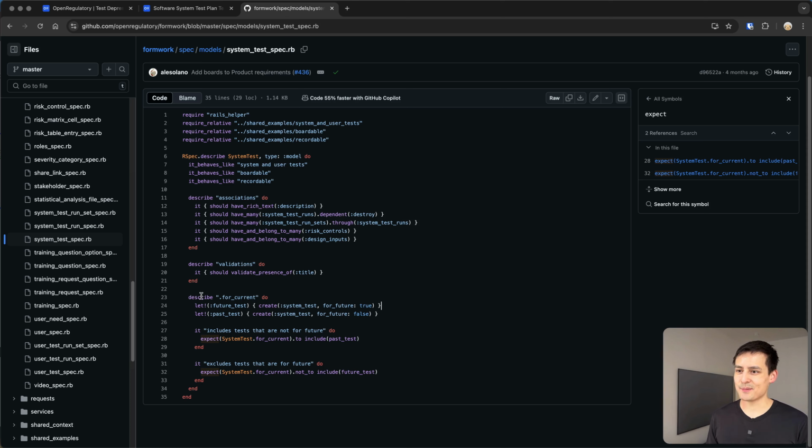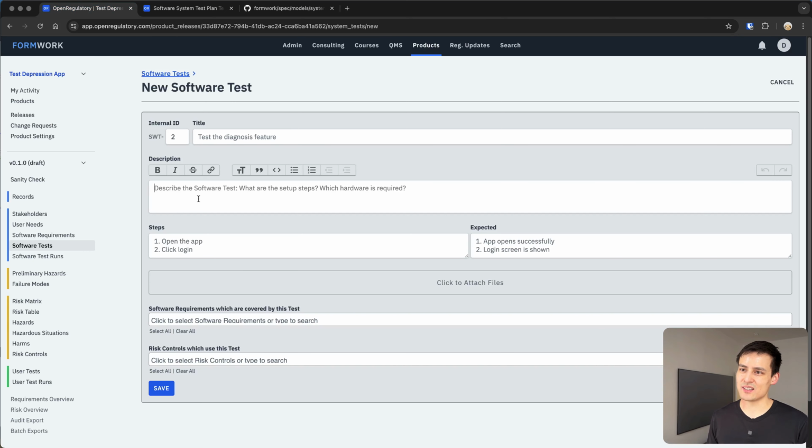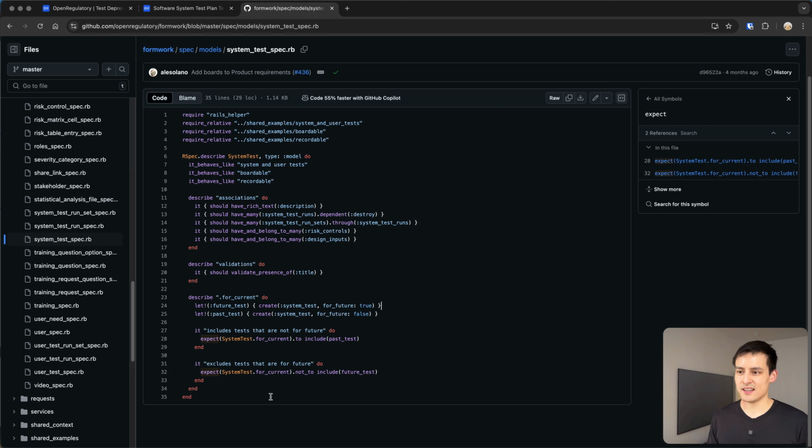Like you could kind of parse this out, and I think there's some sort of way to output this. You could just string these strings together, and then you would come up with a description. It's still not super human readable. Do you have human readable steps, where you say, okay, step 1 does this, step 2 does that? Not really.